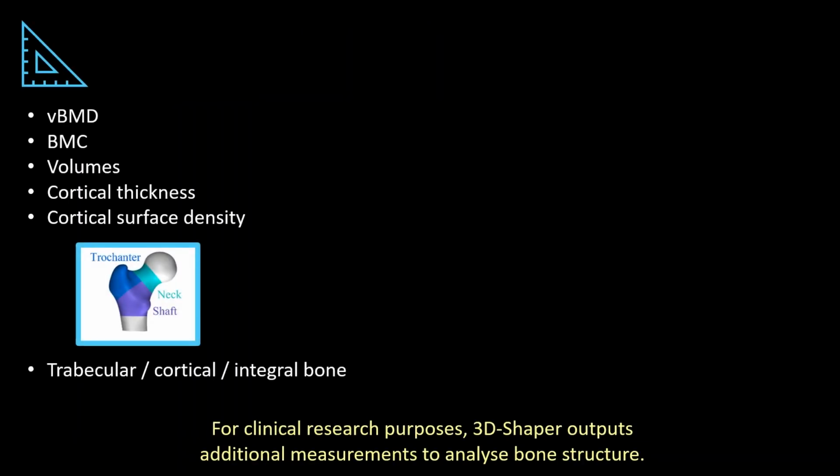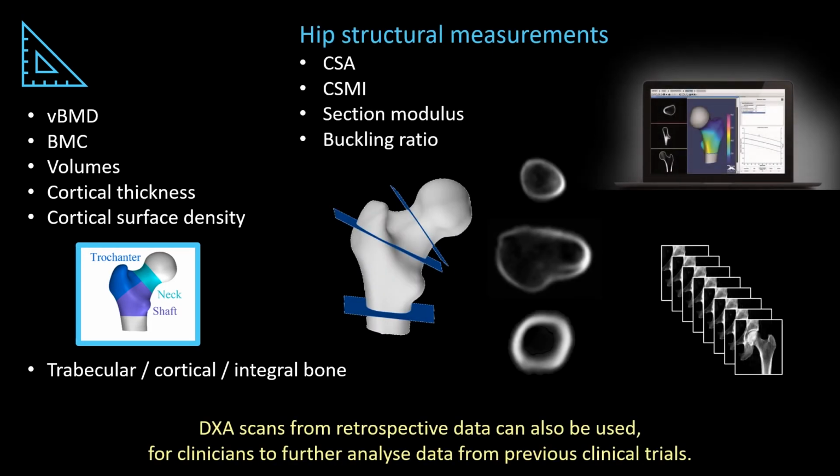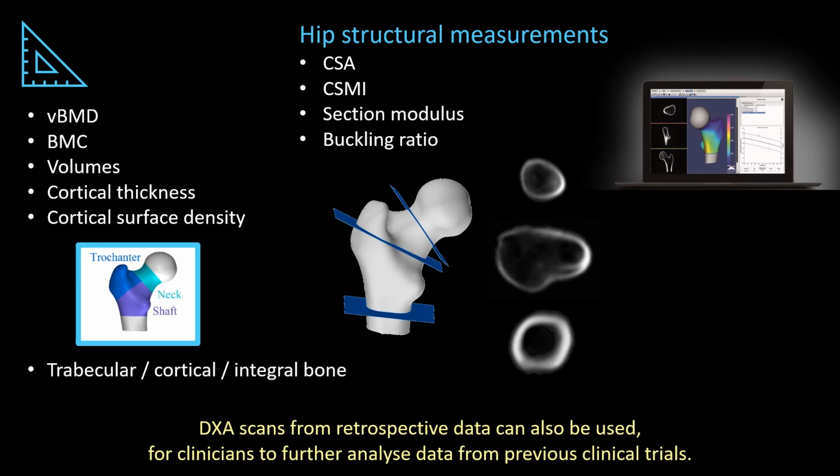For clinical research purposes, 3D-Shaper outputs additional measurements to analyze bone structure. DXA scans from retrospective data can also be used for clinicians to further analyze data from previous clinical trials.